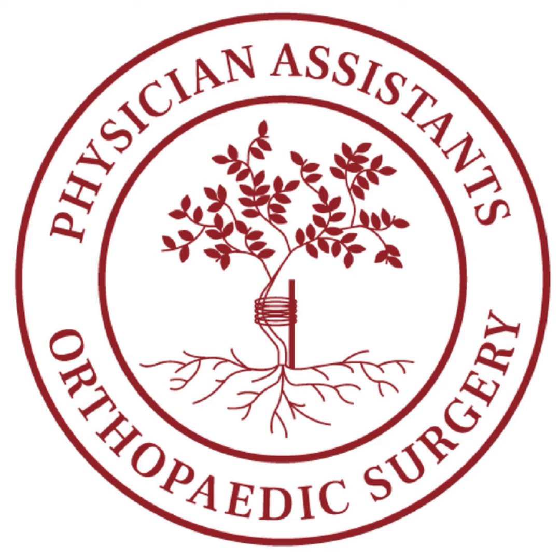Again, it's important to have it done by a surgeon who does a lot of ankle replacements, so they think about all of these things. They're comfortable with the dissection and avoiding damaging the blood supply. If you damage the blood supply to the talus, the bone can die, no different than any other living tissue. If it doesn't get blood, it won't get the nutrients and it can actually die. And dead bone is called osteonecrosis, which is a recipe for disaster for an ankle replacement. The implant won't mend to the bone and it'll collapse into the dead bone.